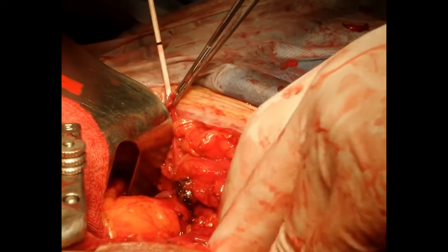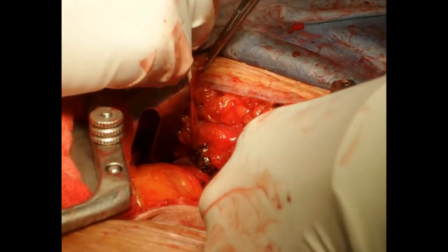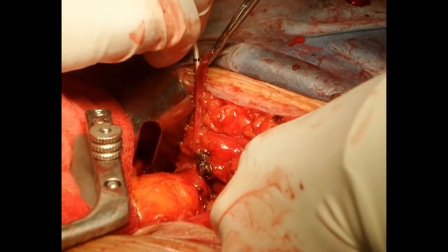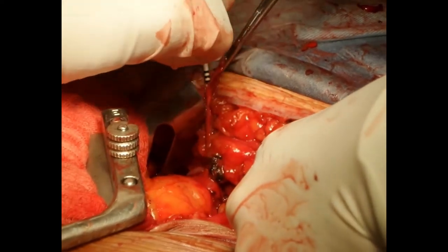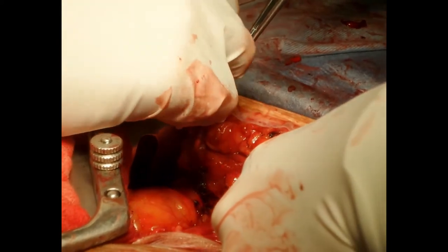A standard JJ stent is put in place. We confirm with one finger at the level of the transplanted kidney pelvis that the proximal part of the stent gets in place safely.